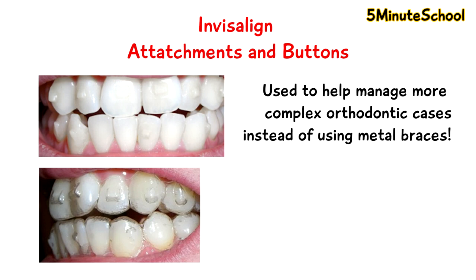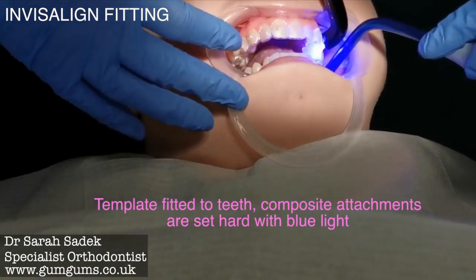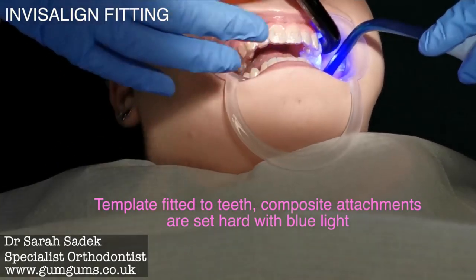So let's talk about these Invisalign attachments first. These attachments are used when your dentist can't use only the aligners to straighten your teeth. What these attachments are — they're very small pieces of filling material which are bonded directly onto your tooth.